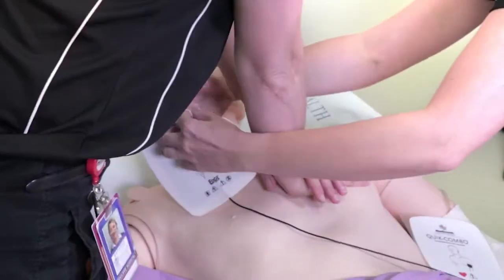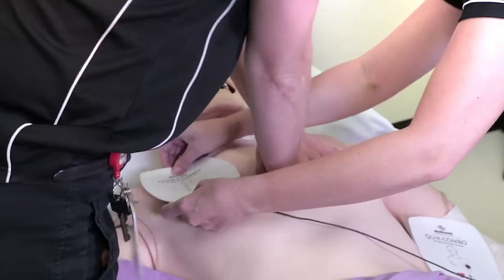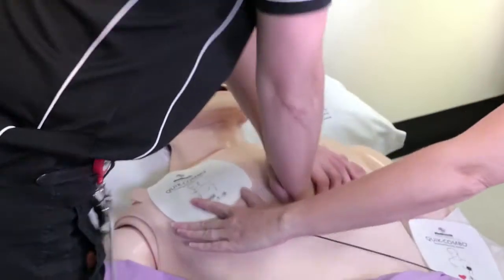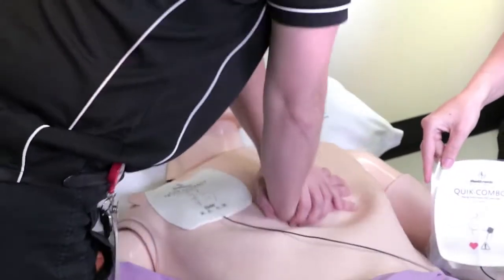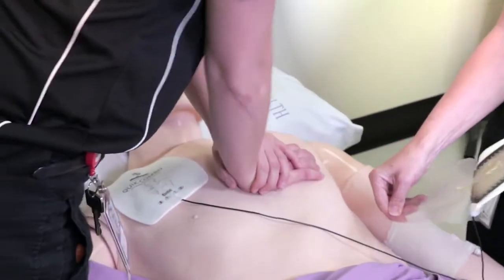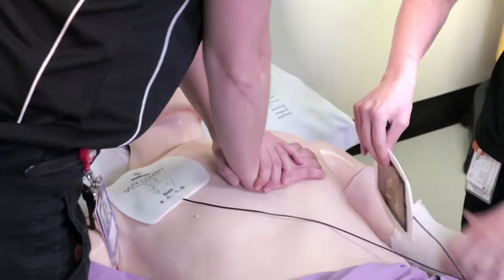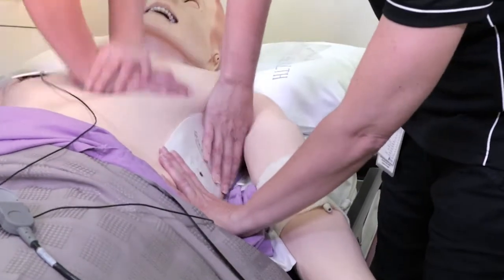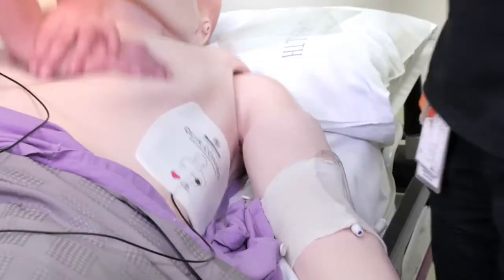The first pad is to be placed over the second intercostal space, mid-clavicular line, and often you can use the clavicle and sternum as a border for this pad. The second pad, which displays the heart symbol, is placed closest to the heart — sixth intercostal space, mid-axillary line. Avoid breast tissue and always place the pad underneath the breast.